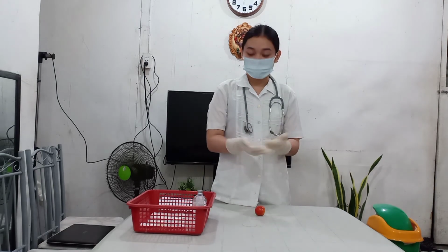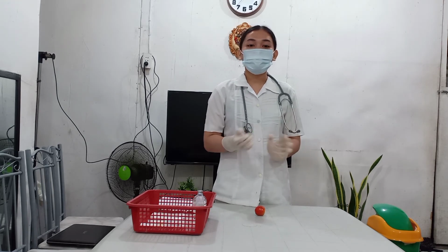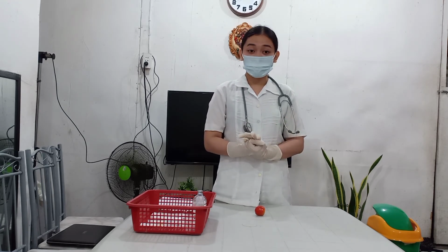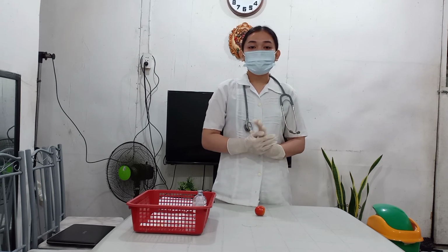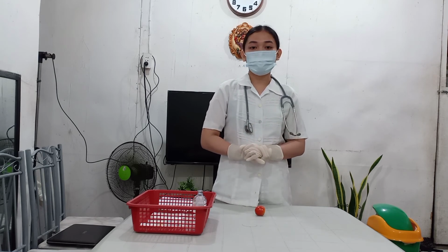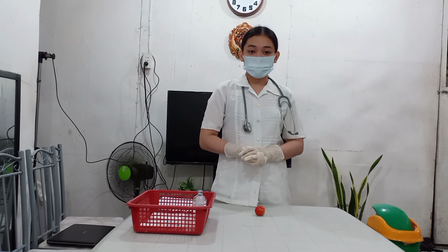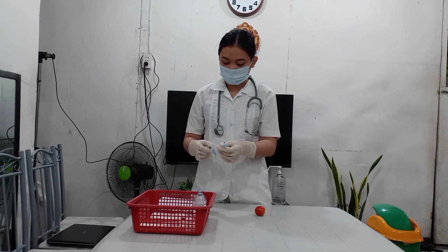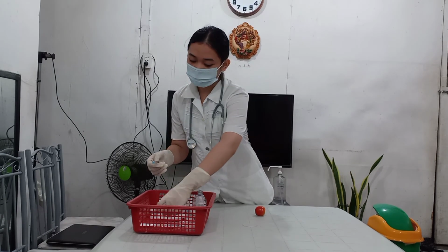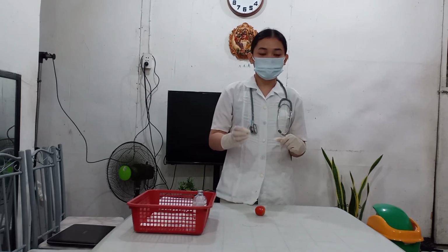Now, while waiting for the antiseptic to dry we will then proceed to the next step, which is to remove the needle cover and discard without contaminating the needle. This technique lessens the risk of accidental needle stick and also prevents inadvertently unscrewing the needle from the barrel of the syringe. So, I have here a 3 cc syringe. I've already removed the cap and the needle is already exposed.